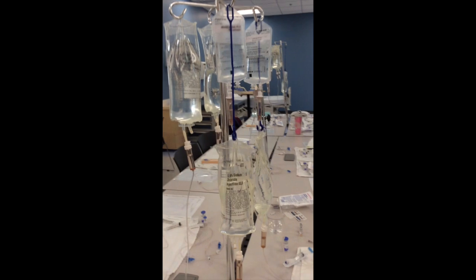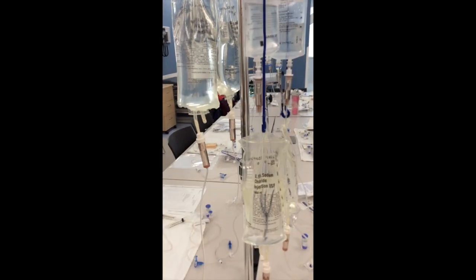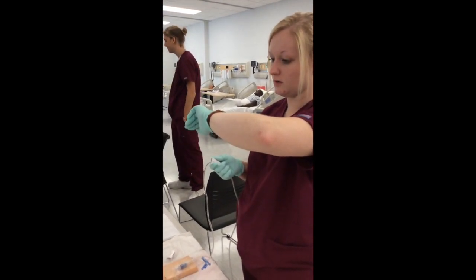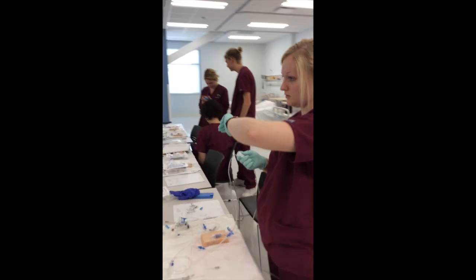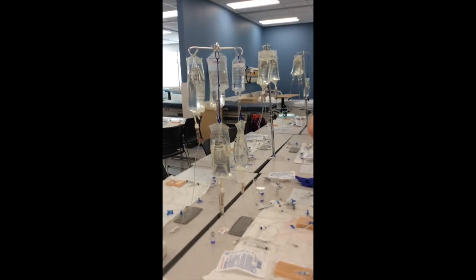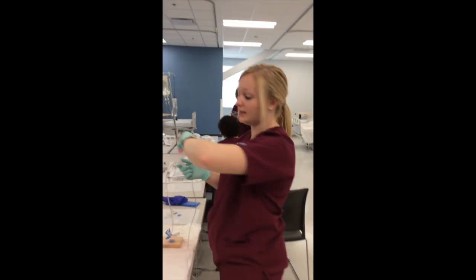So there my drops go. I was getting a little worried there. I'm going to go ahead and count for 15 seconds.